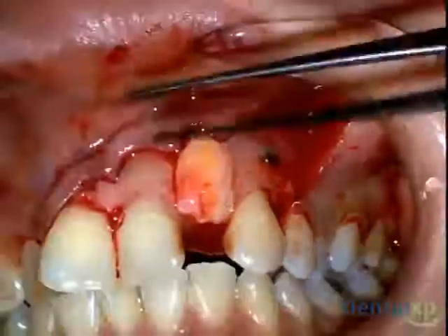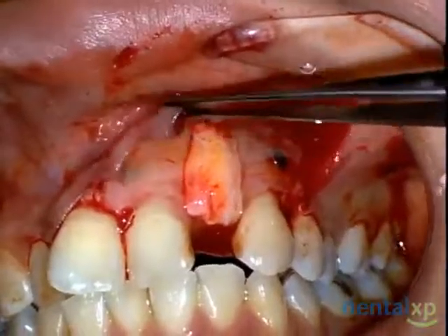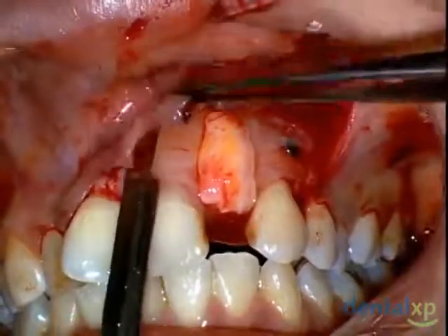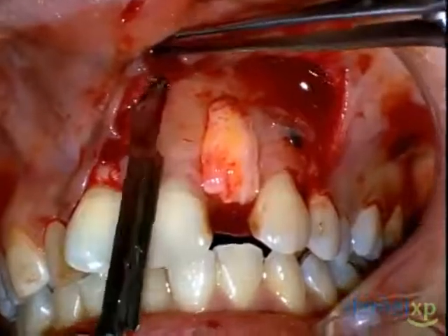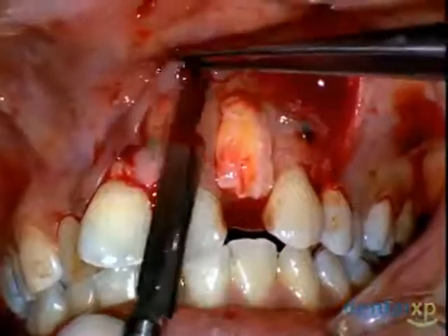This allows us to completely correct the defect in its entirety, both the bone as well as the soft tissue nature of the volume of this defect. One of the most important aspects is tension-free closure of any regenerated area.